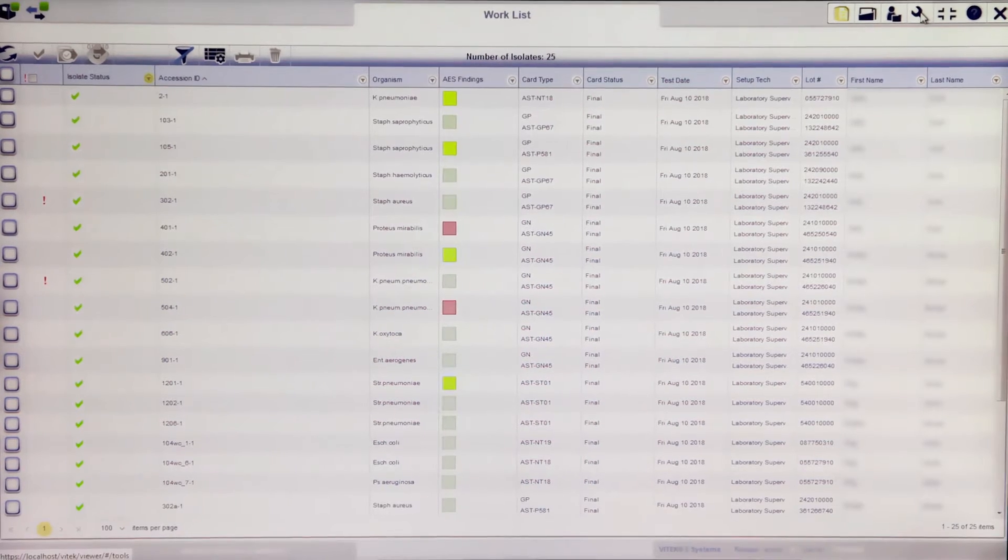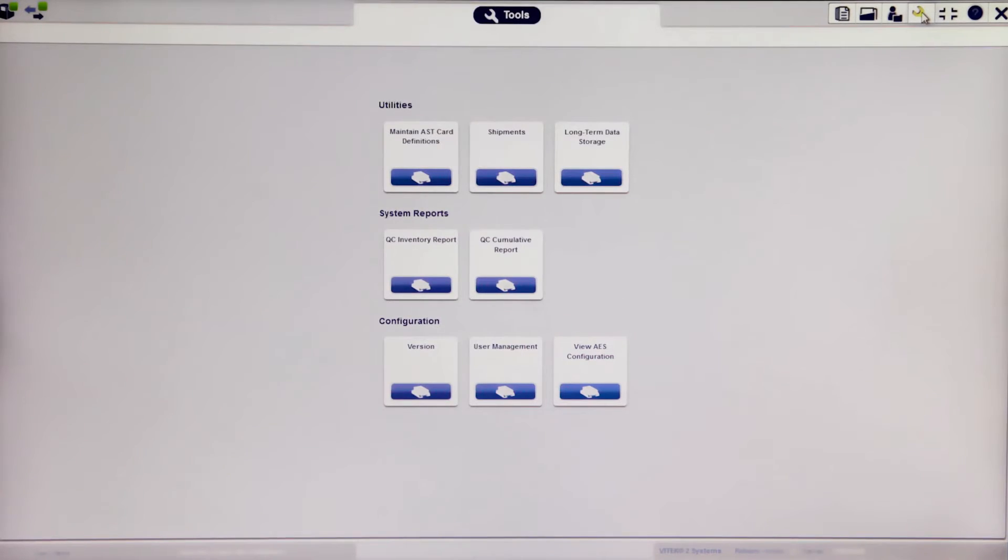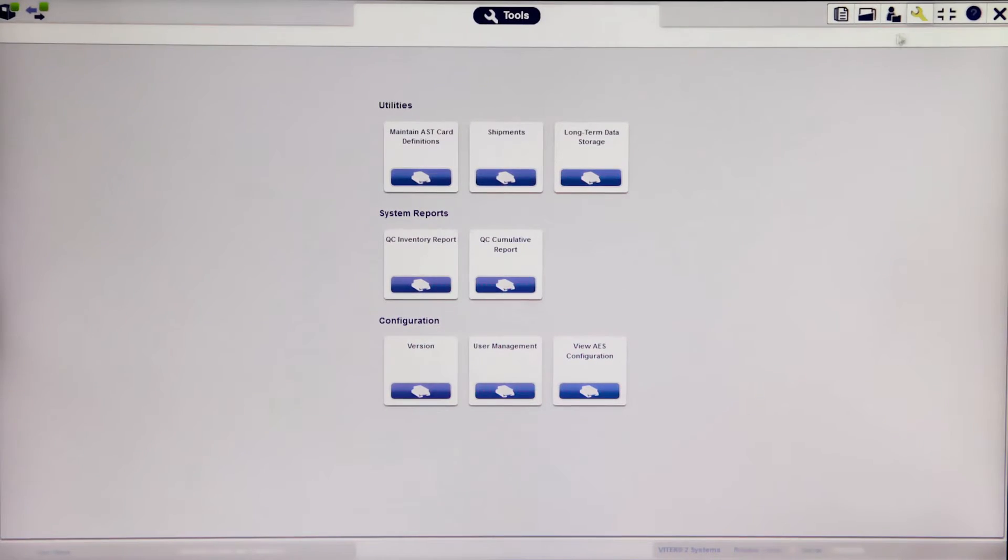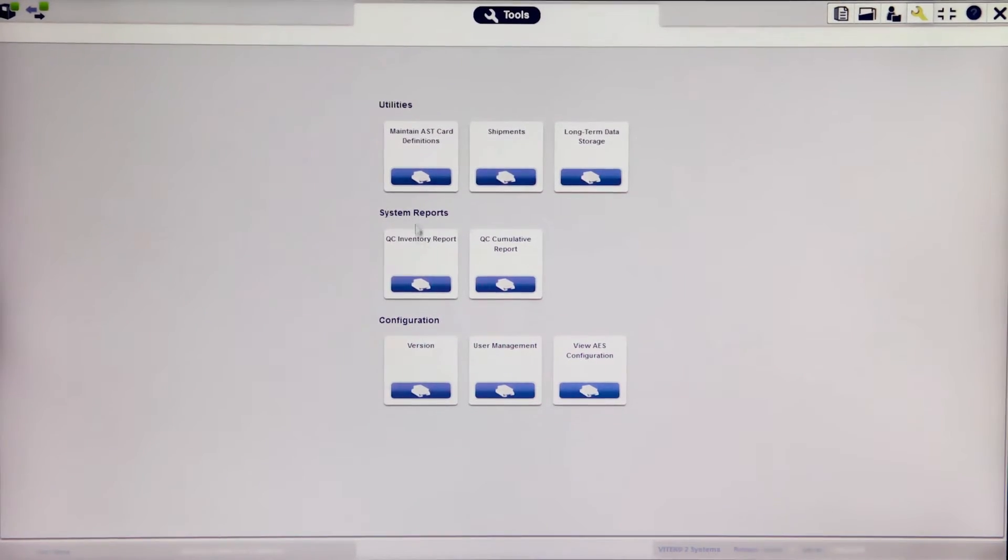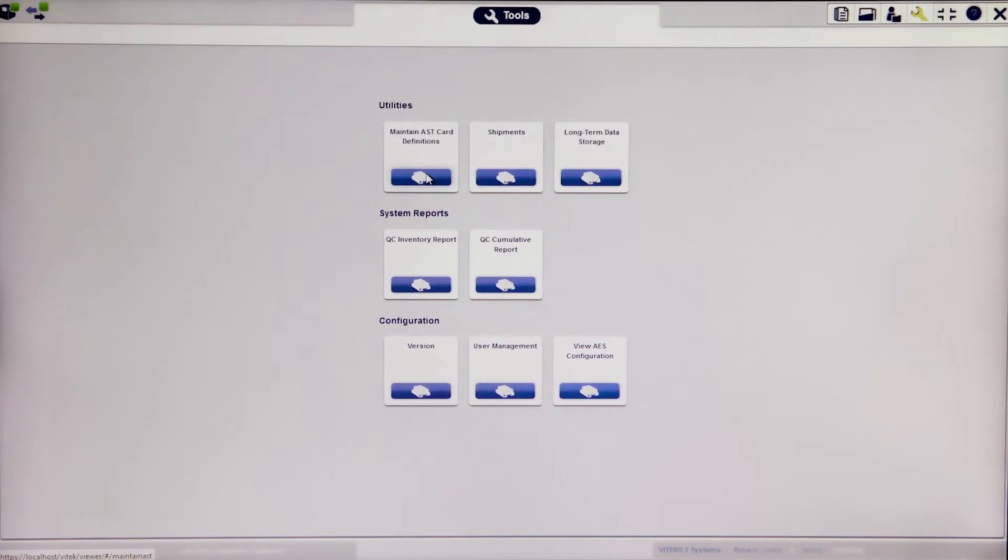Navigate to the Tools menu. Click on the Maintain AST card definitions button.